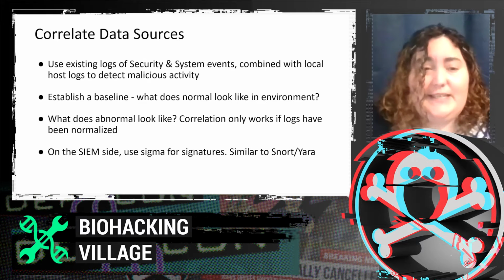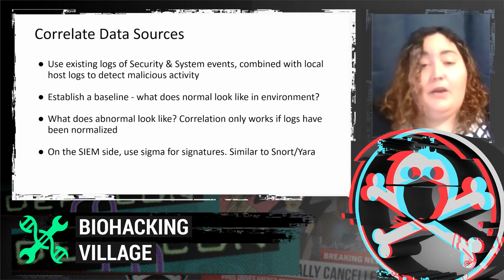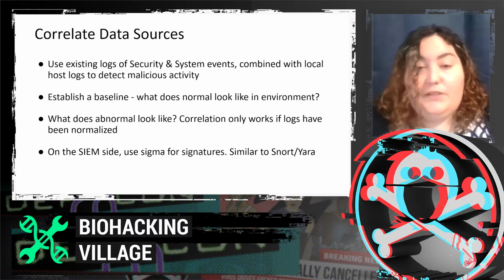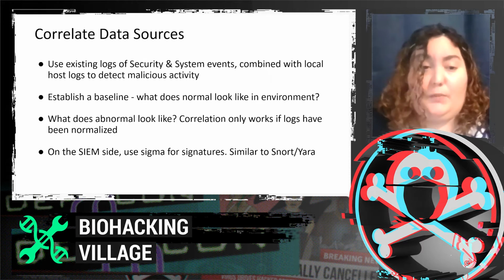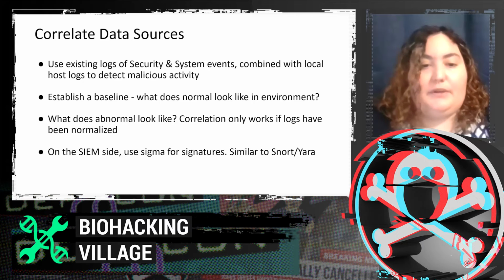For this, you're going to need to establish a baseline. You're going to have a period of time where you are figuring out what is normal in your environment. And once you know what normal is, you can start to define what abnormal looks like. Correlation only works if your logs have been normalized.